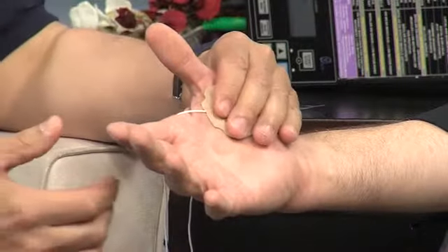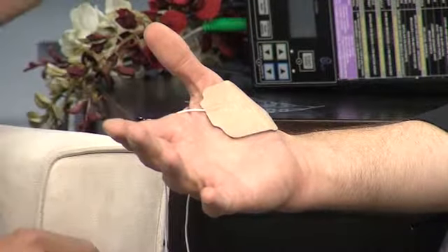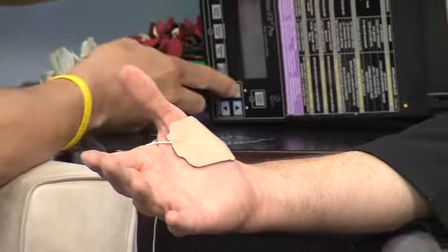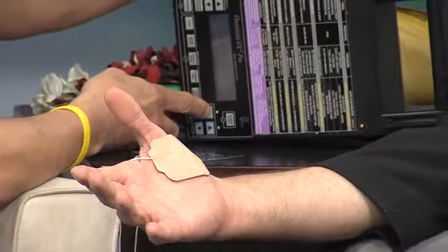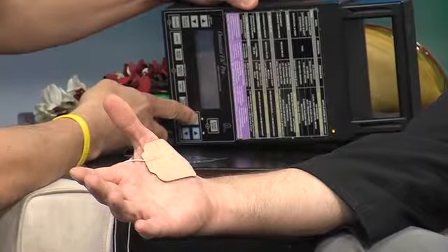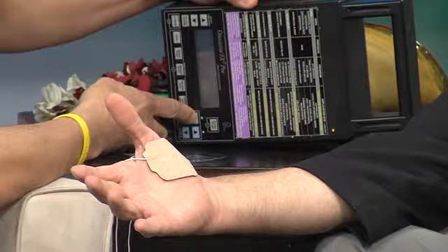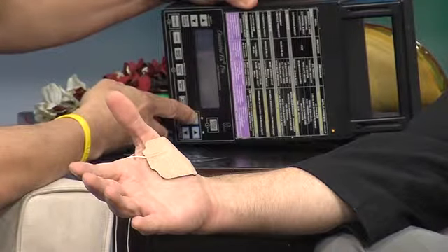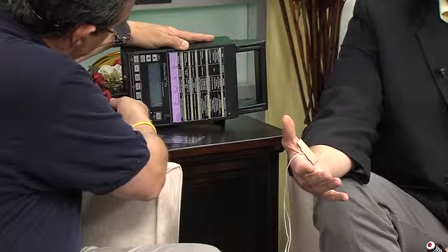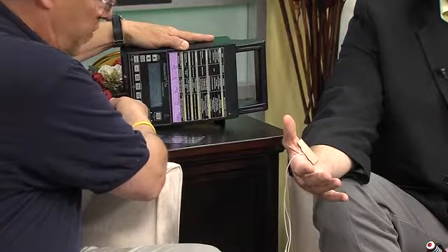— keeping you from zipping your zipper or putting on a button, a PT and OT would also be treating you. One of the ways we'd address the pain or dysfunction would be electrical stimulation. What you're going to feel is a slight pulse. We're not starting out at 220 — it's not meant to be painful. What we're going to do with this treatment is actually get your thumb muscle to start functioning. You'll actually be able to see your thumb start pulsing.